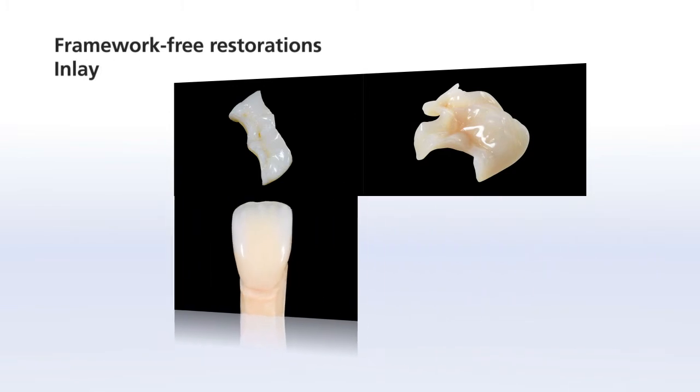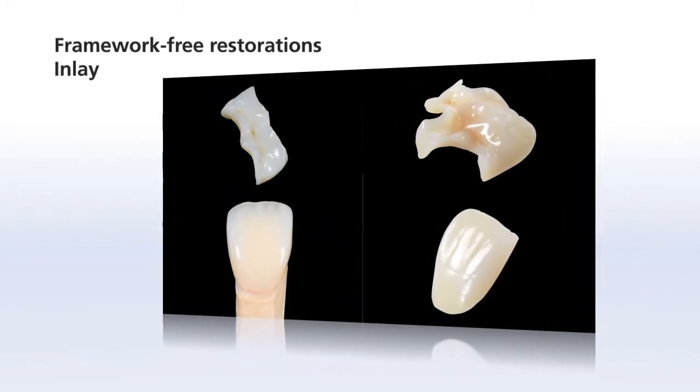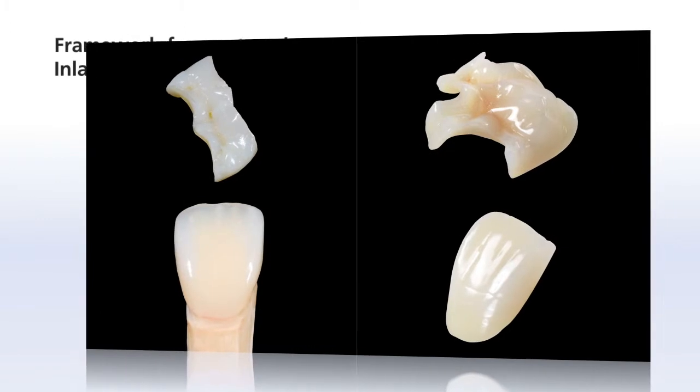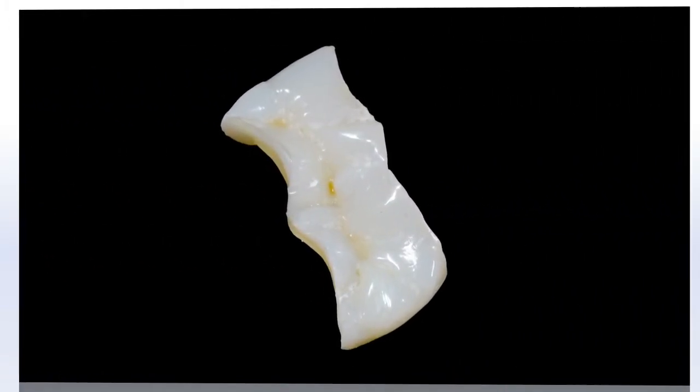SR-NEXCO can be used for various framework-free restorations. These restorations include inlays, onlays, anterior crowns and veneers. This chapter shows you how to use SR-NEXCO to create an inlay.